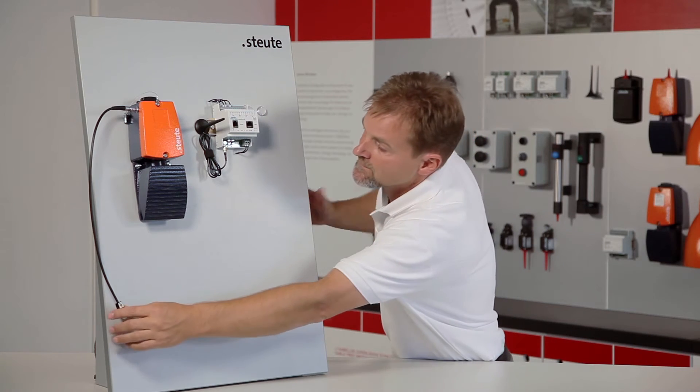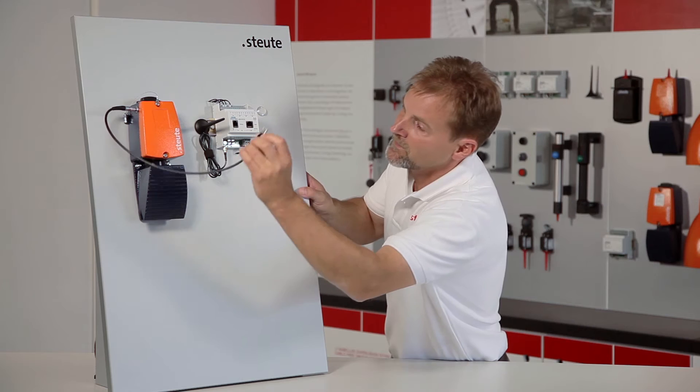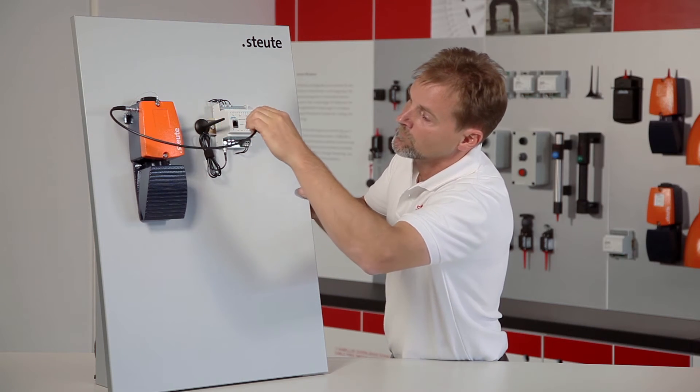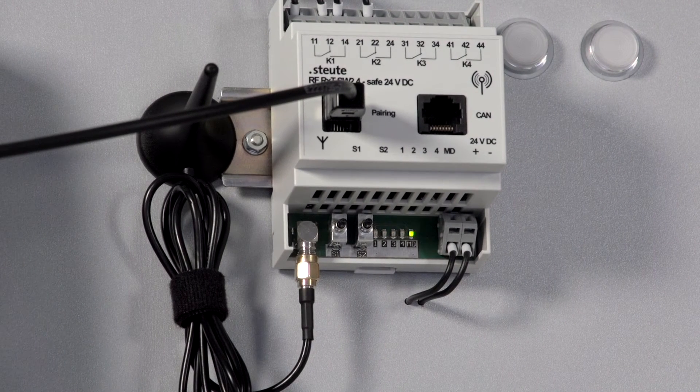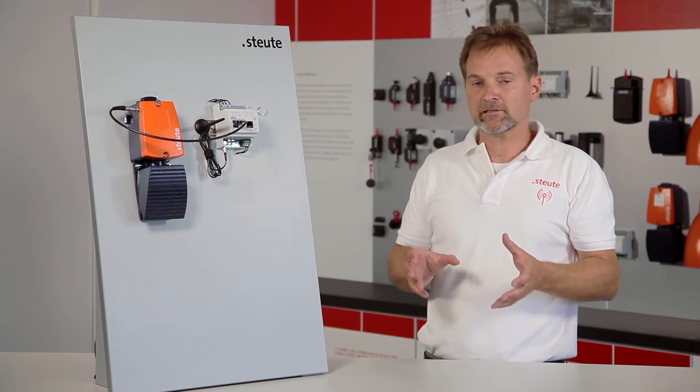From this moment on, we have 20 seconds to take the pairing cable and link the wireless foot control interface with the pairing interface on the wireless receiver. A triple beep acoustic signal from the wireless receiver is confirmation that pairing was successful.